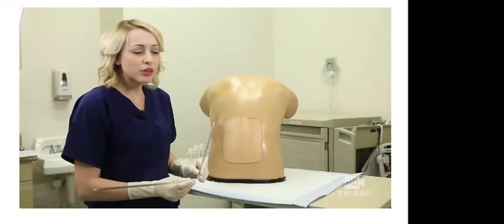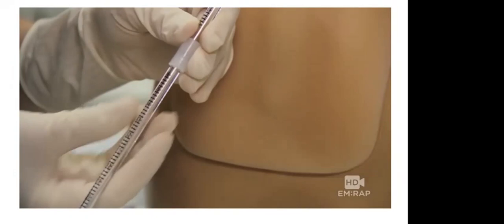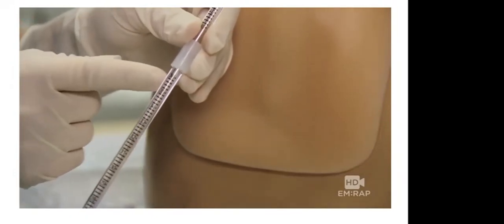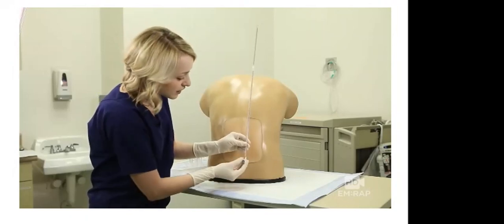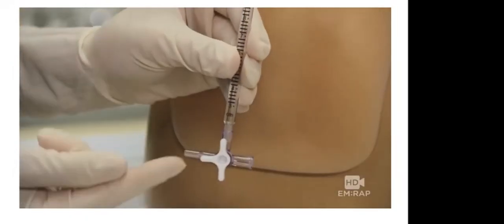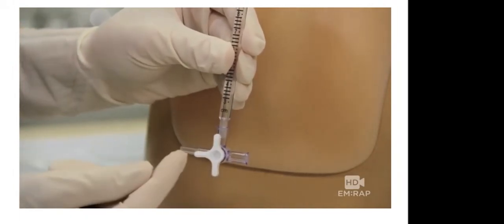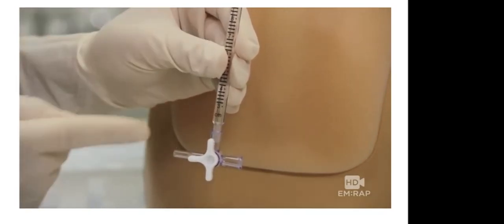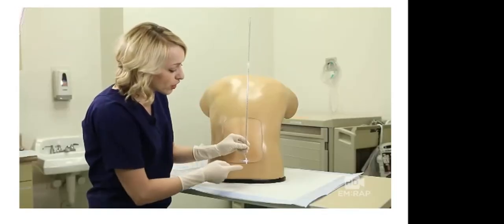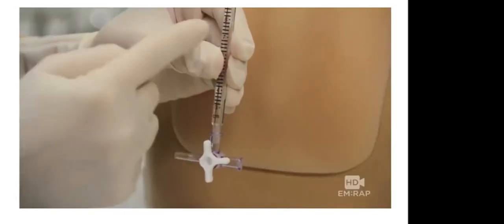To set up the manometer, take the two pieces of tubing and connect them. That way you can measure pressures greater than 36 centimeters of water. Now we're going to get the three-way stopcock and connect it here. And your spinal needle will connect right here. Make sure the three-way stopcock is open to the spinal needle and to the manometer, so the fluid column can rise up the manometer. Once you're done measuring your pressure, you're going to turn that three-way stopcock so you collect the fluid from the column into your collection tube.